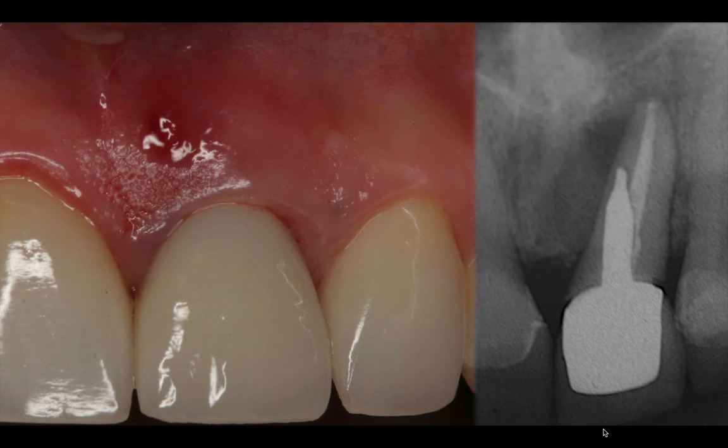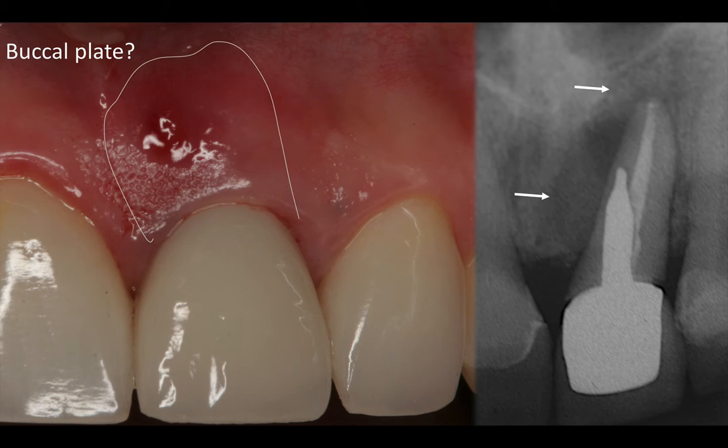So if you're looking at the periapical radiograph and the clinical picture, there's a lot of things that you can learn just from that. You can learn about the condition of the buccal plate. If you're looking at the extent of the infection towards the mesial and the apical part of the tooth, plus the draining fistula, you can probably assume that the majority of the buccal plate is now missing. How much? We're going to find out. But it's definitely a disaster. It's going to be a pretty significant defect in there.